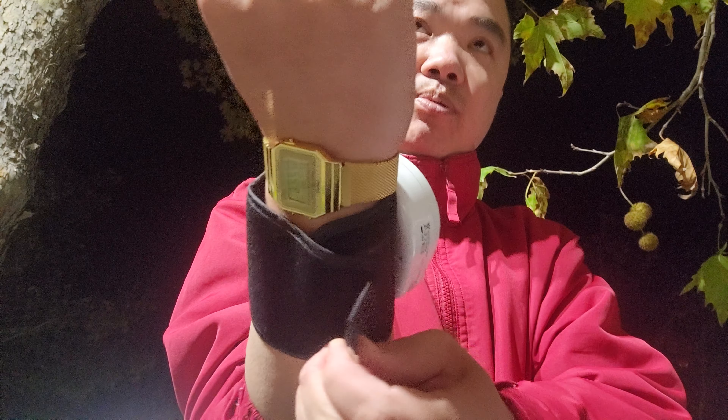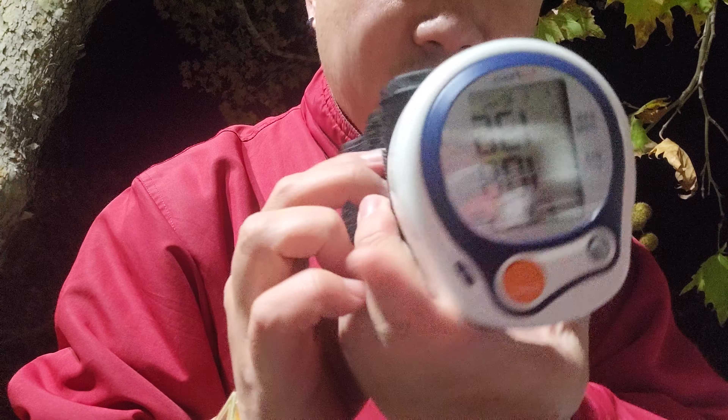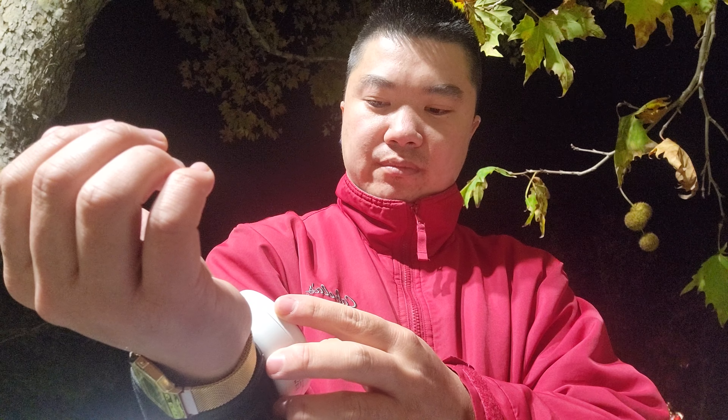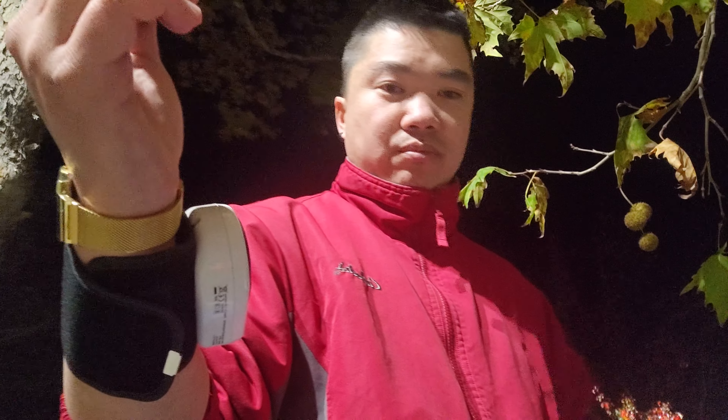Wow, I guess my blood pressure is a little bit high. It is showing 136 over 100 right now, and my heart rate is 84. That's probably my co-worker calling. Let me try this again because earlier I was talking and the cuff had to reset and pump more air, so I don't know if that was the cause of it, but we'll see. I really like this look — we're starting up again.